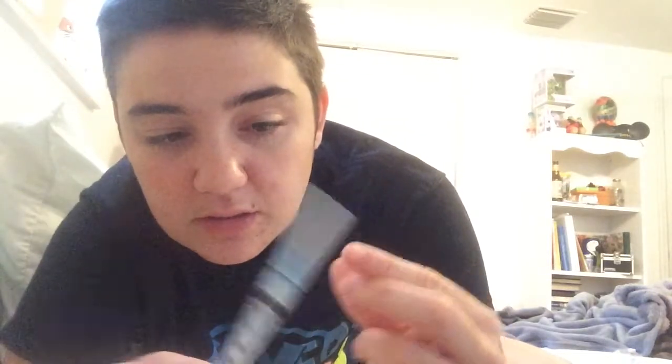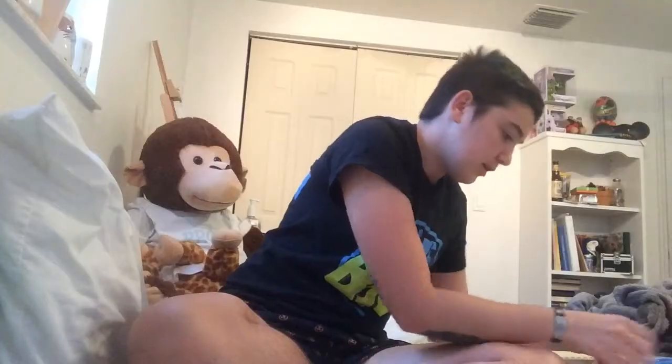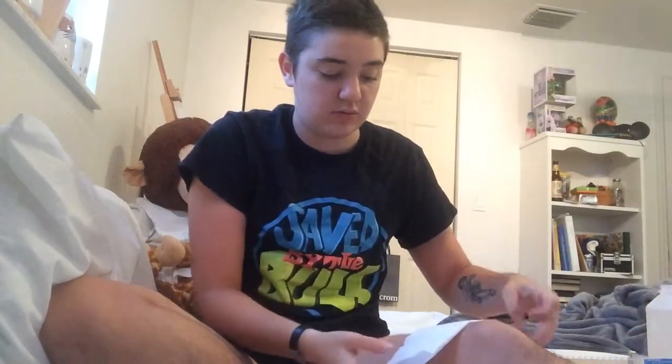So this one already comes with a tip, which is the blue one. And then this is my green one, which I use for extraction. It's a lot thicker and it's a lot bigger than this one. So the first thing I have to do will be to switch them out. I also have rubbing alcohol. You can either use alcohol pads or rubbing alcohol with a tissue.